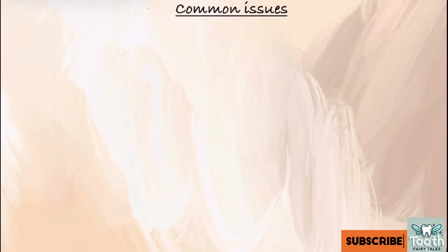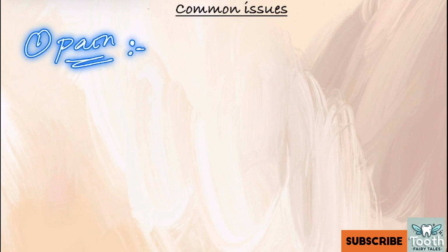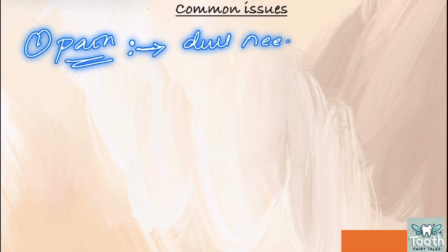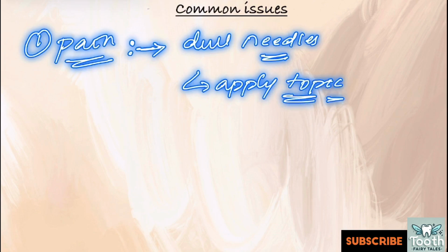Next, let us discuss the common issues with the needles. First is pain on insertion. So, why? What is the cause? This can be due to a dull needle, which happens after repeated penetrations. To minimize the discomfort, always apply topical anesthesia before needle insertion and stretch the tissue slightly.